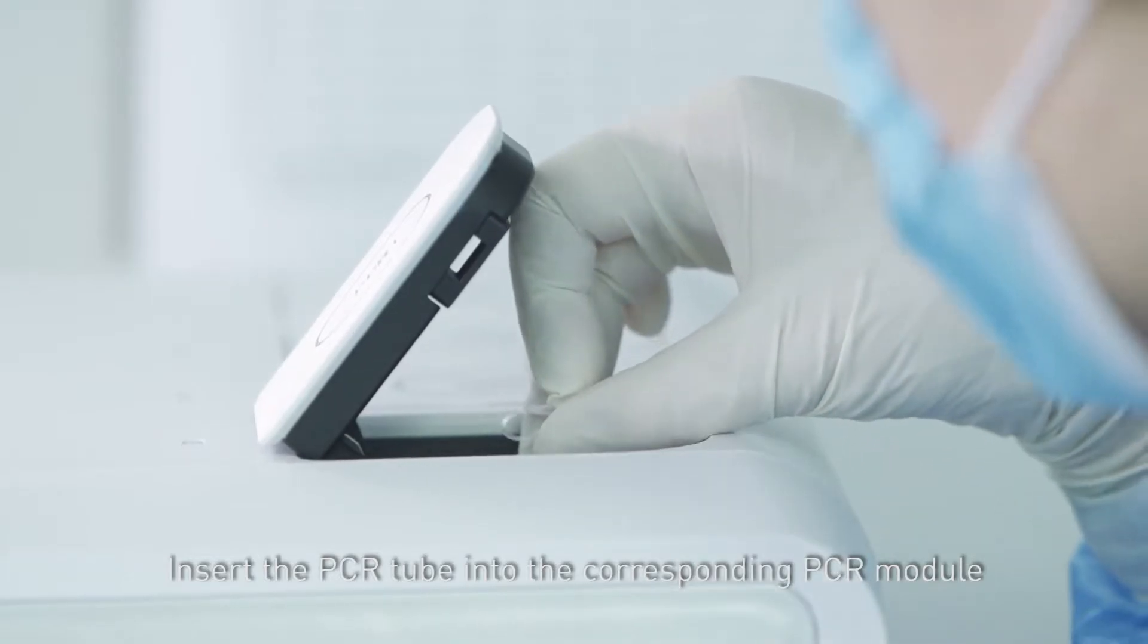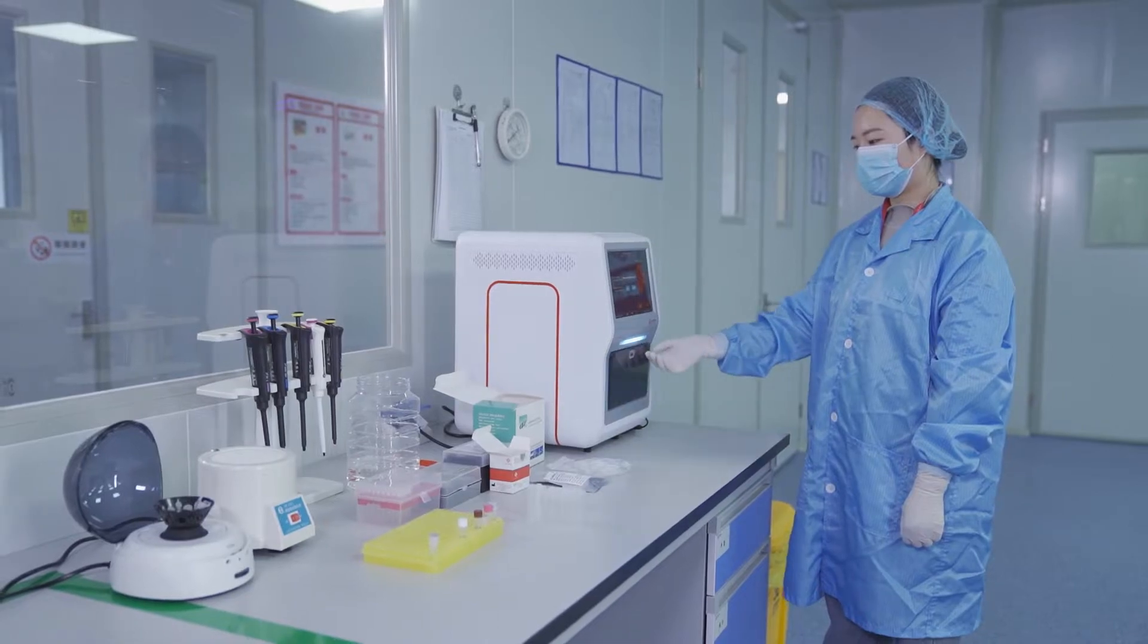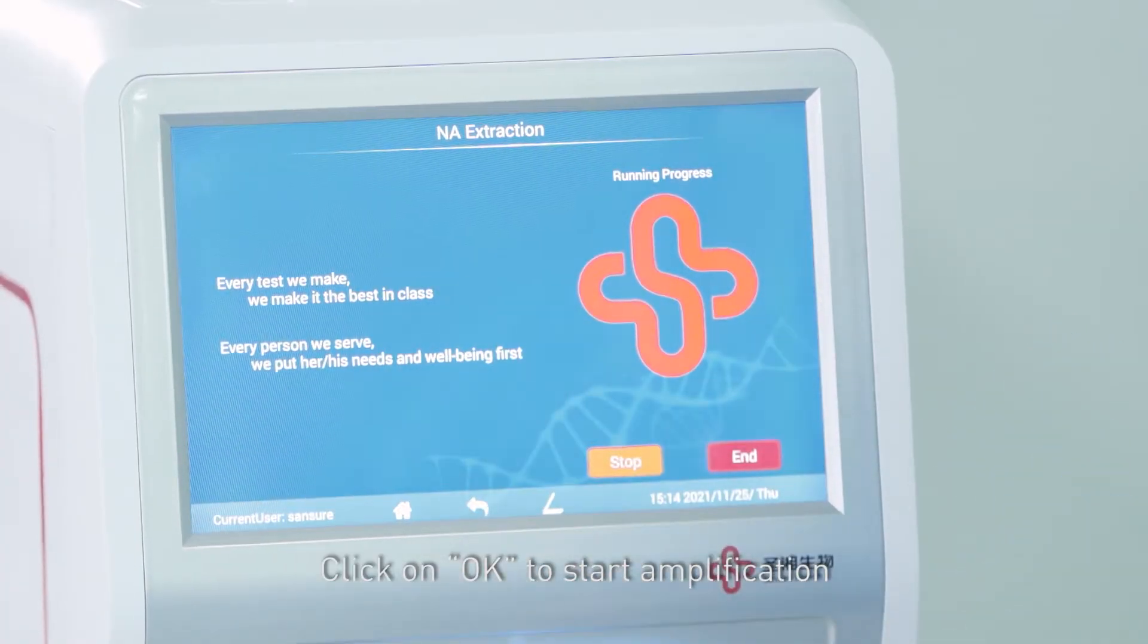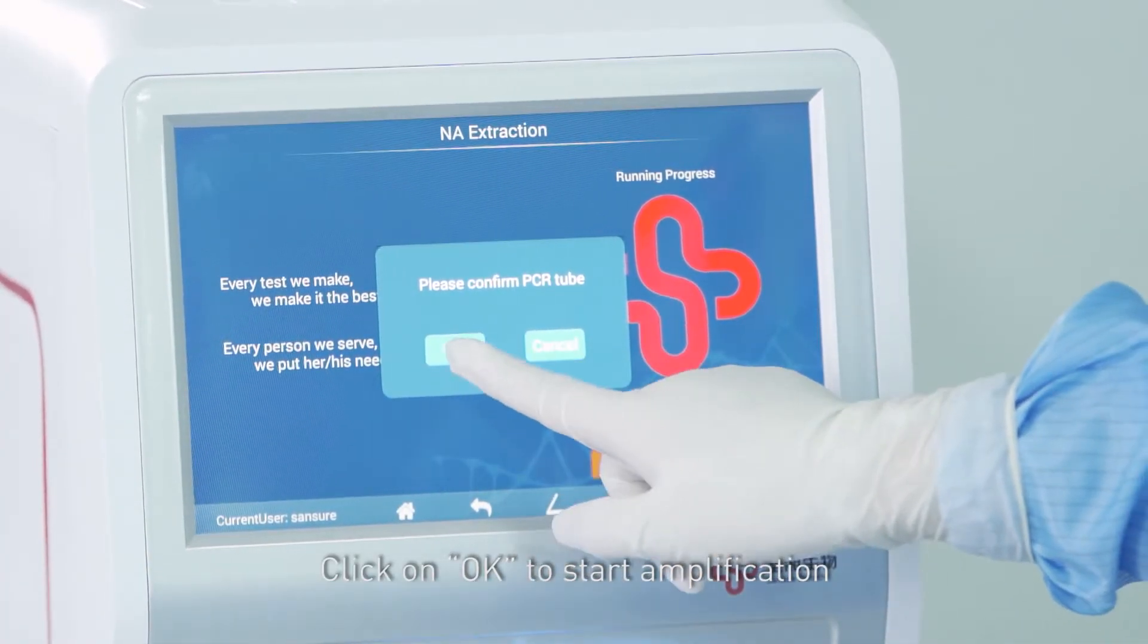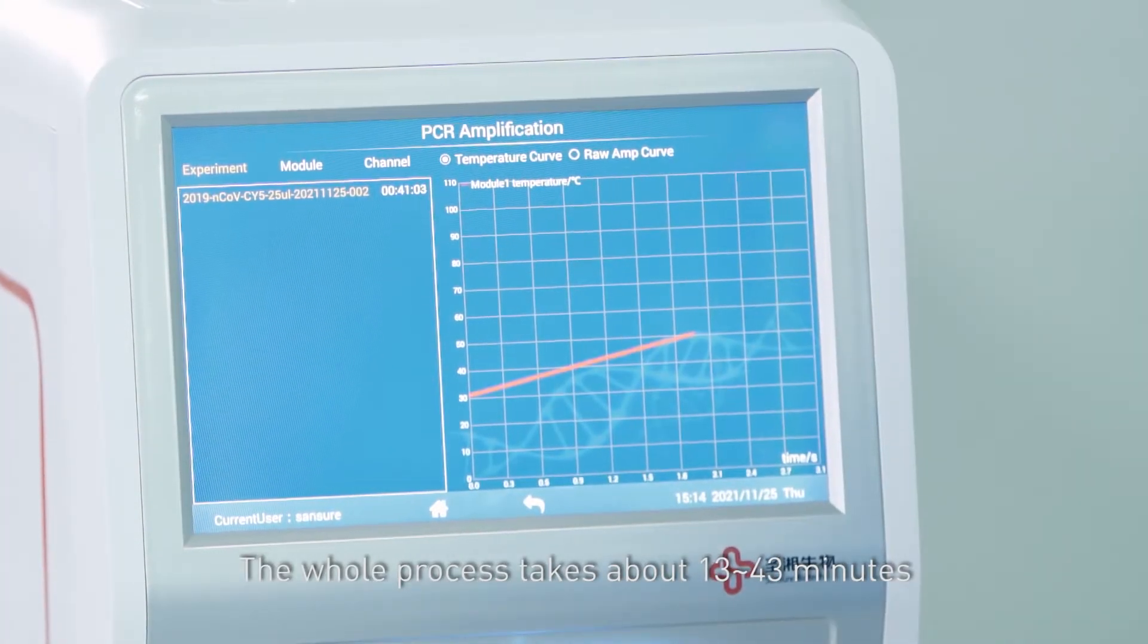Insert the PCR tube into the corresponding PCR module. Click on OK to start amplification. The whole process takes about 13 to 43 minutes.